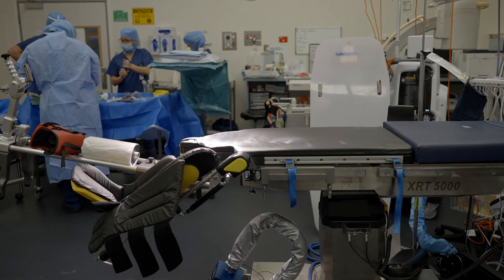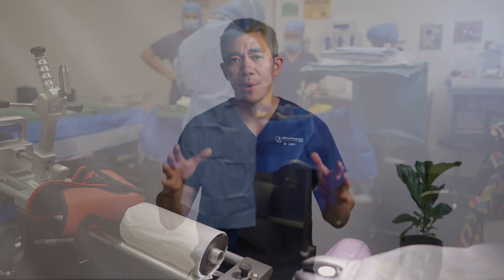I really prefer performing all of my operations with my patients supine, meaning lying flat on your back comfortably during surgery. We use a very specialized bed composed of carbon fiber, and that allows me to image your hip during surgery. I feel this is an integral part of the quality assurance for positioning the hip prosthesis, as it allows us to see all of the elements that we may not be seeing just by looking at the bone.